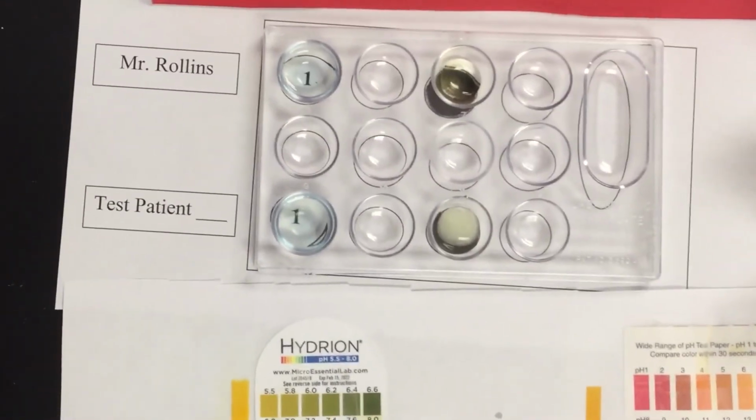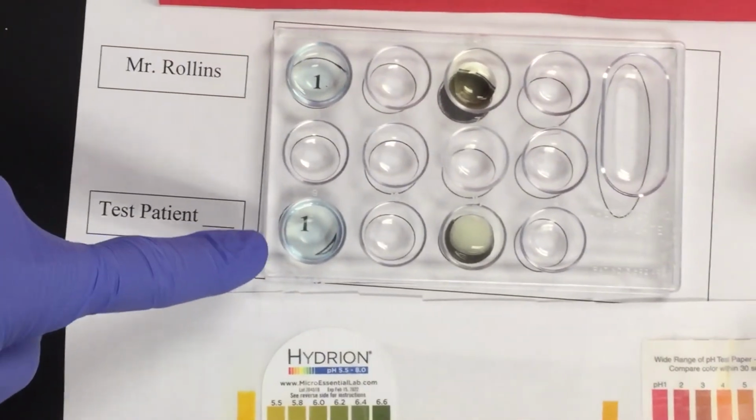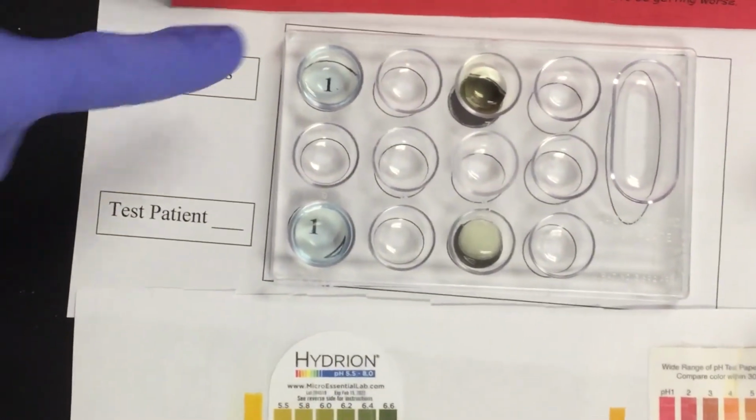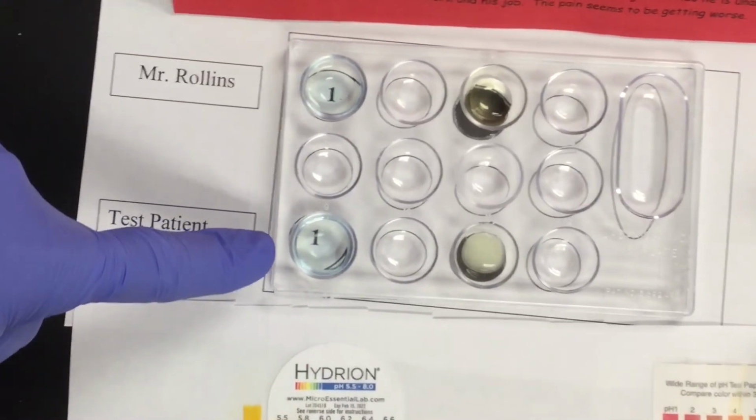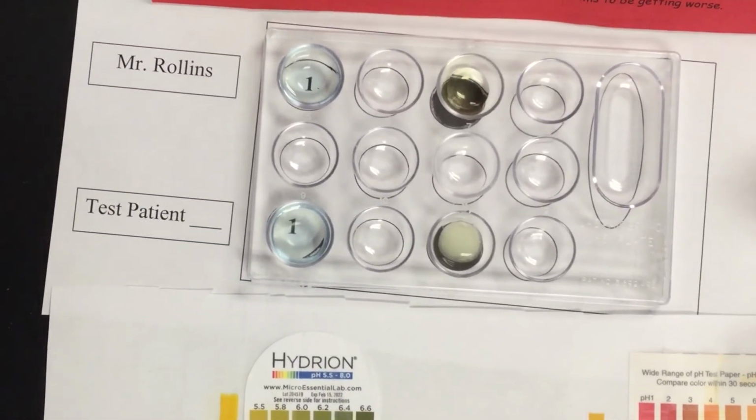Next, we have the tests for proteins and chlorides. The top row is Mr. Rollins. So here and here are Rollins's tests. Your patient 16 is here and here. For protein, the biuret solution was added. They look kind of the same there. So mark your proteins, whether you think he has them or not.